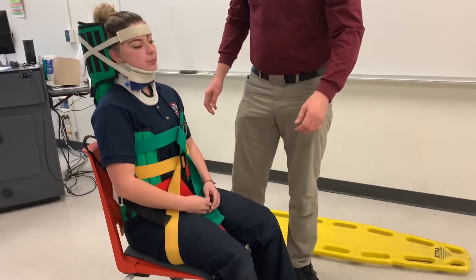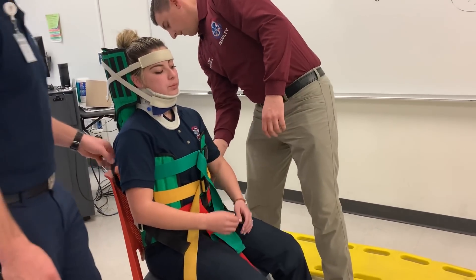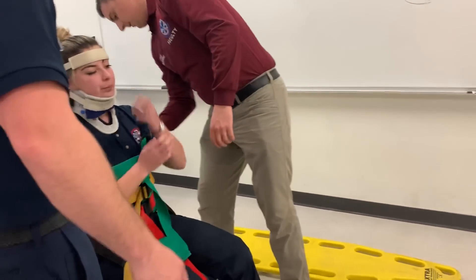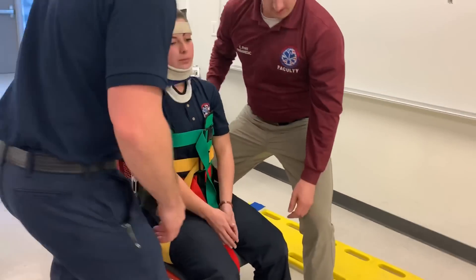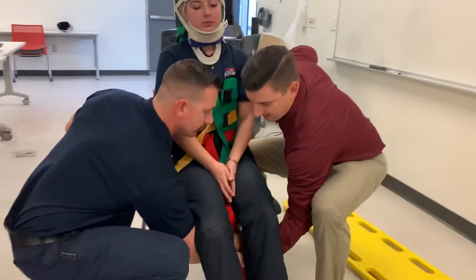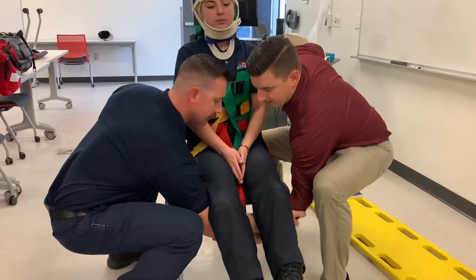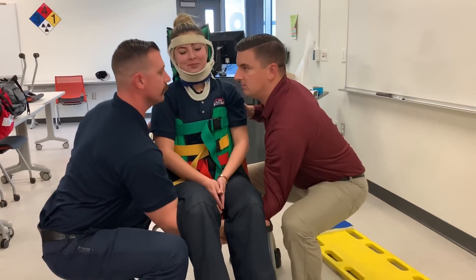We're going to move the patient onto the board, maintaining proper lifting technique and interlocking arms. One, two, three.